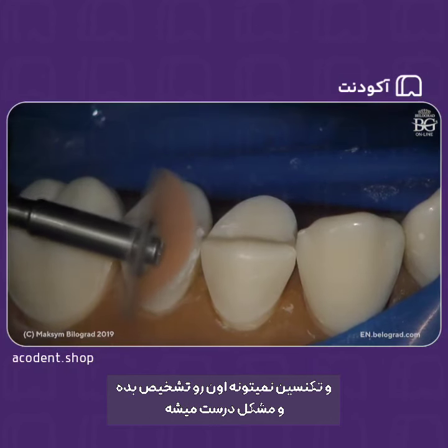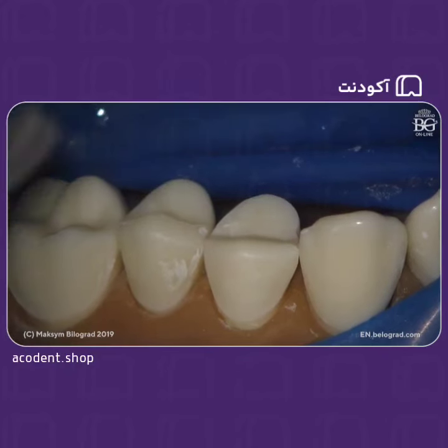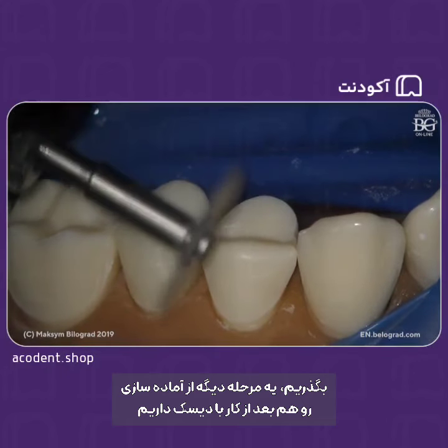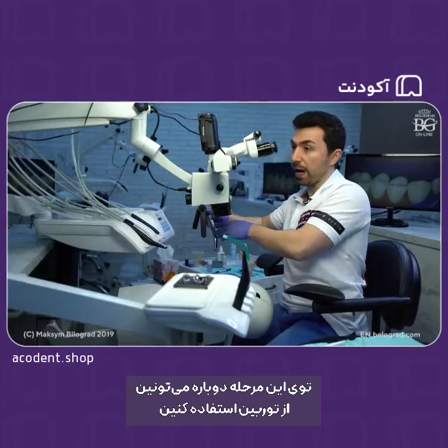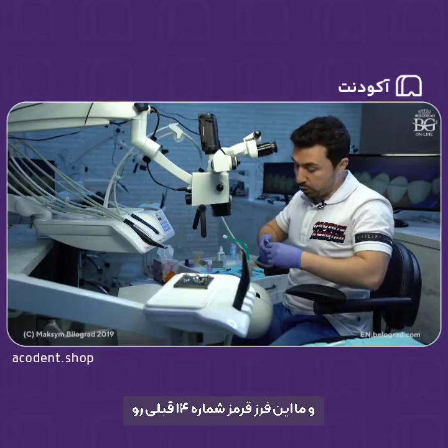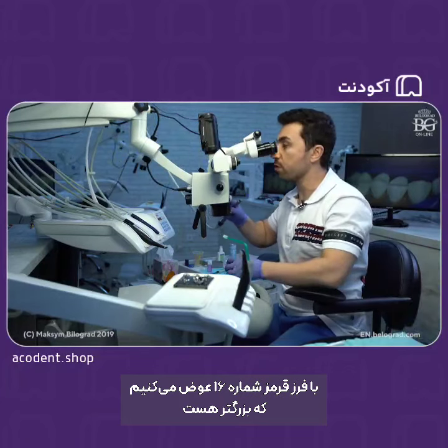It will be difficult for dental technician to identify this finish line. But anyways, we have another step of preparation. After you finish with disc, you can go back to your increasing handpiece. Okay, and we will change this red burr number 14 for red burr number 16.